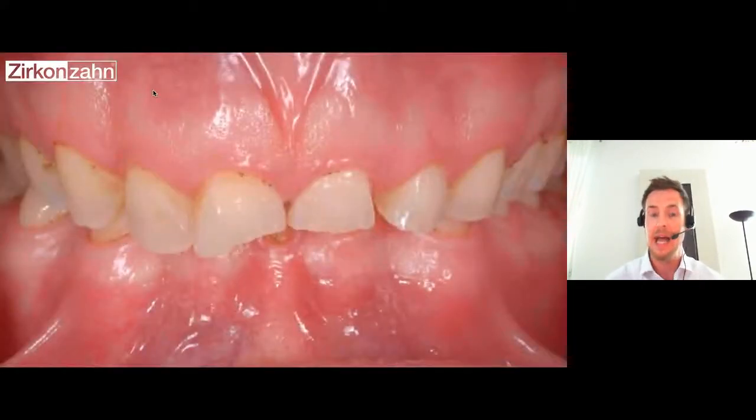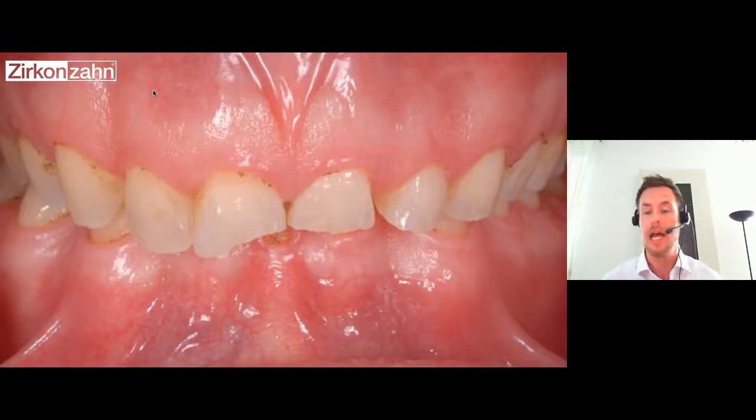The other reason is when I have a patient like him, he is a bruxer and he lost a lot of tooth material, as you can see, and vertical dimension as well. It's not really clever to start with a final restoration. It's better to adapt the new vertical dimension, the new occlusion surface, by using a really soft material in the shape of an anatomic bite splint.